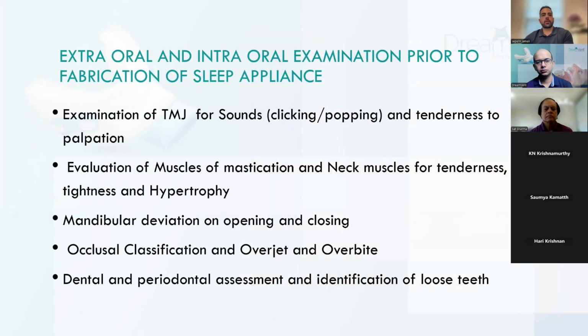Another factor that we're going to talk about right now is before making any of these sleep appliances, because as we know, traditionally all the sleep appliances are just going to bring the lower jaw forward, and this in itself is going to put some strain on the jaw muscles. But on the other hand, you want the patient to be able to use the sleep appliance most of the night for at least the next few years that they are dealing with it. So it's going to be something that they need daily use. So it's very important to check the current condition of all the TMJ and the muscles of mastication and the neck, and make sure that we know their baseline.